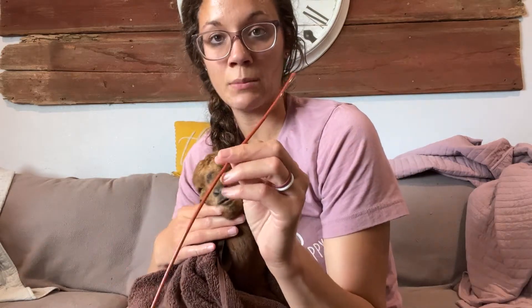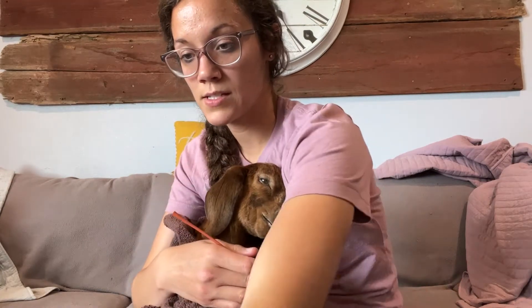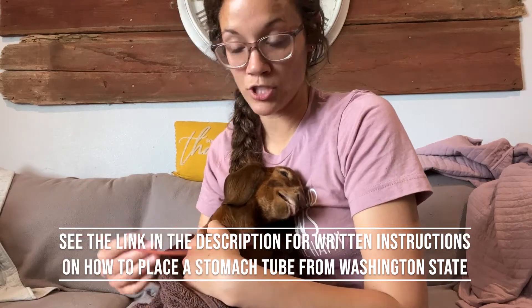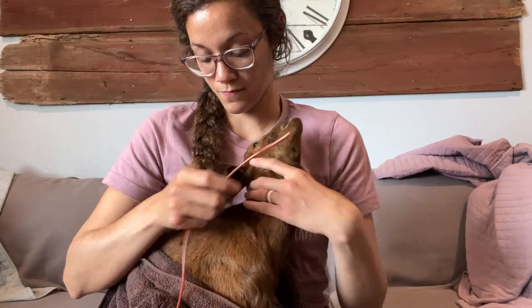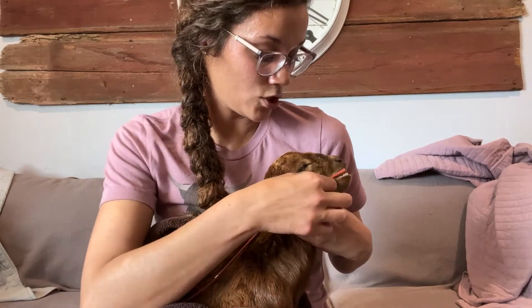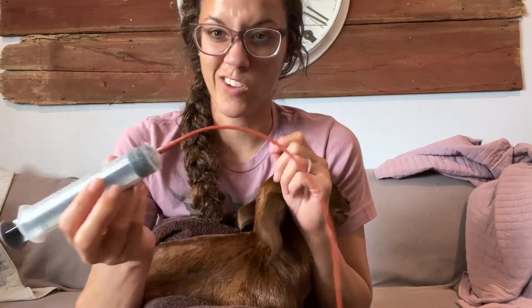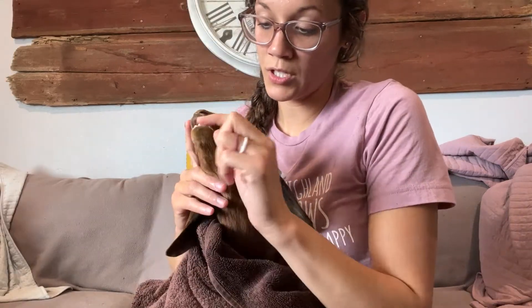We just got this from our vet — you can get them online as well. It's just a baby goat stomach tube with a 60cc syringe. When you're trying to figure out how long it should be, you place it up next to the goat, just behind the ribs where the stomach is, and you can see about how long it should be. This was about right for our goat so we didn't have to trim it. I did trim the wide end so that it would fit down tight — that way you can pull and push. That was the only thing we did with that.